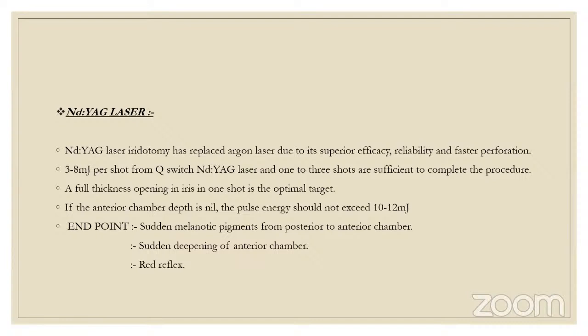But definitely, if the patient is on an anticoagulant, like warfarin or its equivalents, then you must stop it for a week and then do YAG PI, because antiplatelet agents do not have issues with clotting, but anticoagulants will not allow clotting to occur. So you may have more bleeding after doing PI. Make sure you take a proper history of the patient, and remember anticoagulants and antiplatelets are different. You should know what drugs the patient is on before doing any procedure.